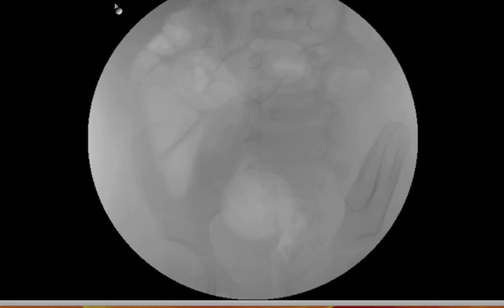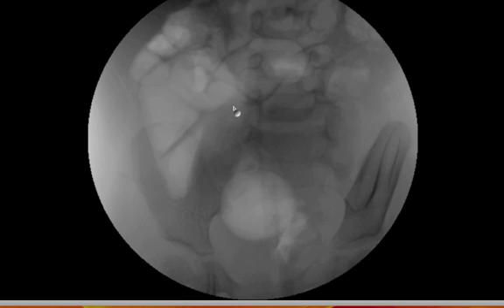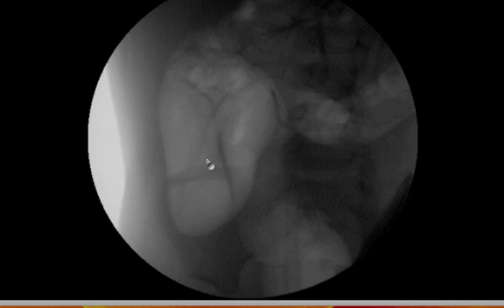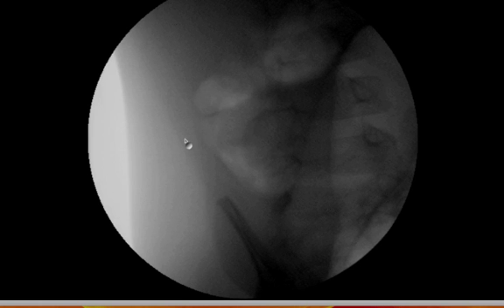We brought the patient into the fluoroscopy suite. We put a rectal catheter in — here you can see the balloon tip is inflated within the rectum. It's secured. We inflated the colon with continuous monitoring of pressure, using a pressure manometer on the flexible bulb to push air in. So we're inflating the colon and filling it up while monitoring its pressure. There was a very redundant sigmoid colon that was folded over the area of interest.